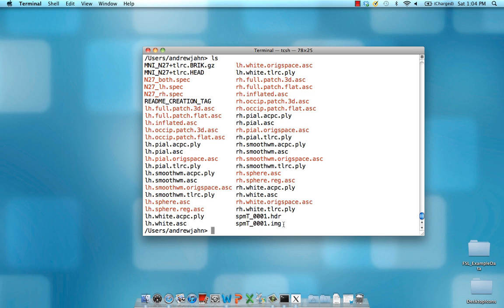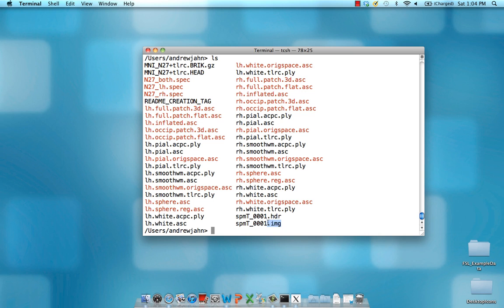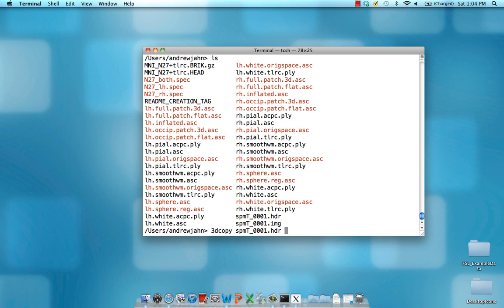You'll also notice here that I have these SPMT files, which have been generated from a contrast — from an experiment that I ran about a year ago. The first thing we need to do is convert this .hdr/.img format into AFNI format, which is brick/head. To do that, we type in 3Dcopy, the name of the SPM file — just use the header — and I'm going to call this AFNI_SPMT.